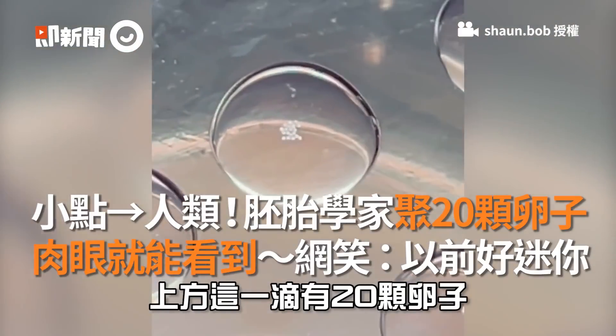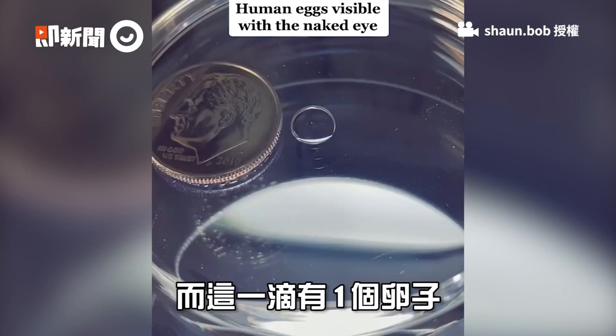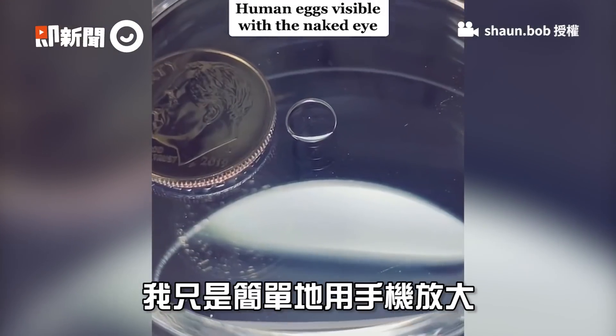That drop right there has 20 eggs in it. This first drop has 10 eggs in it. And this one has one. That's just my phone being held close to the dish before using it.